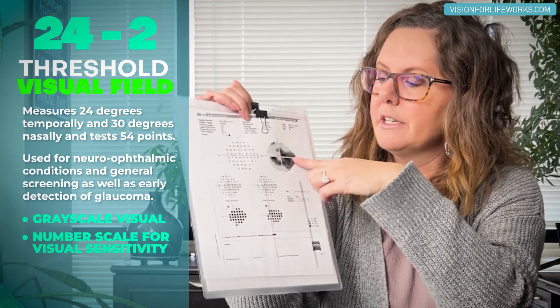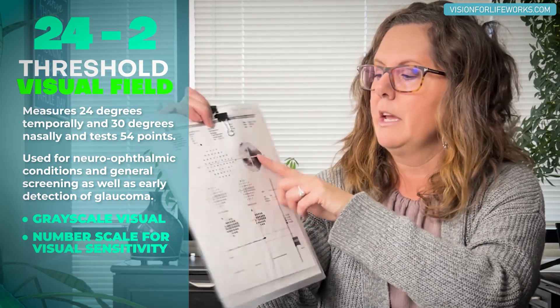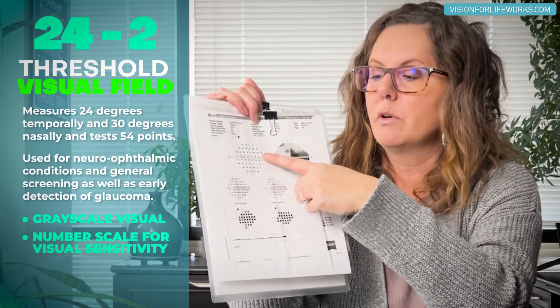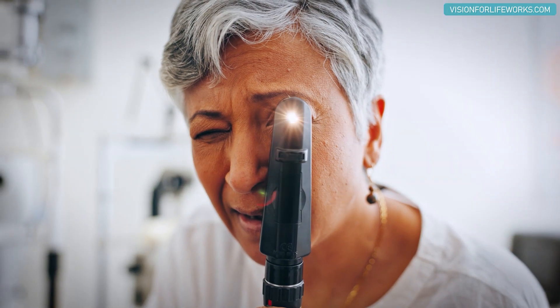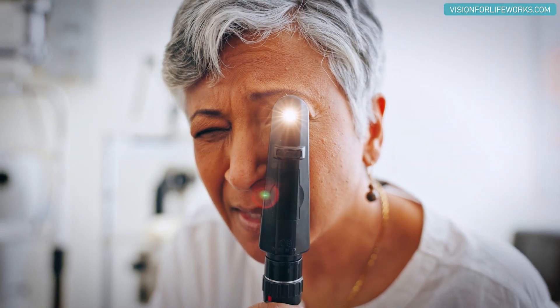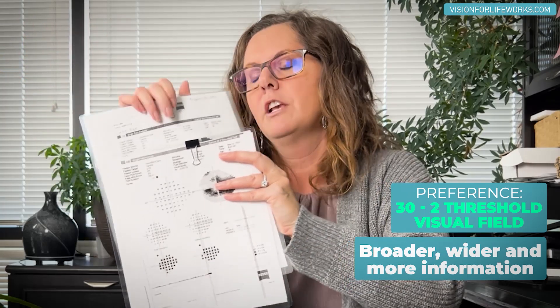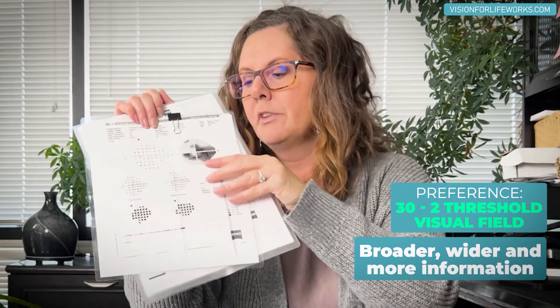What's important is to look at this side and say, where it's really black on the grayscale, there should be a corresponding zero because there's no sensitivity — even the brightest object flashed couldn't be seen. And then if you look at a little gray fuzzy spot, that number might be a 15. This test gives you valuable data just like the 30-2, although the preference is still the 30-2 because it gives a broader, wider view than the 24-2.